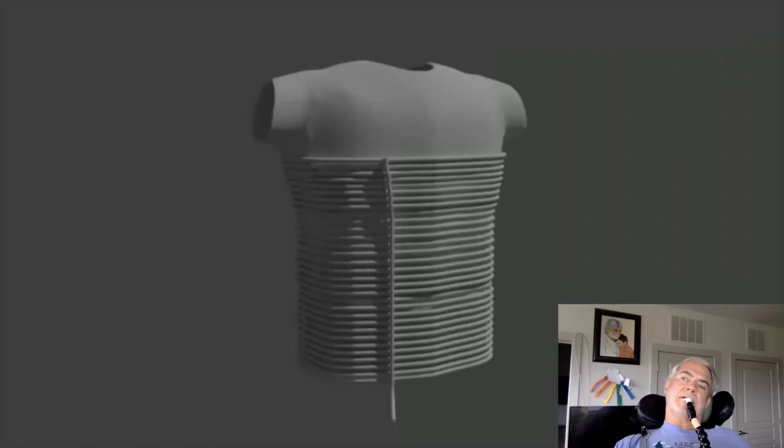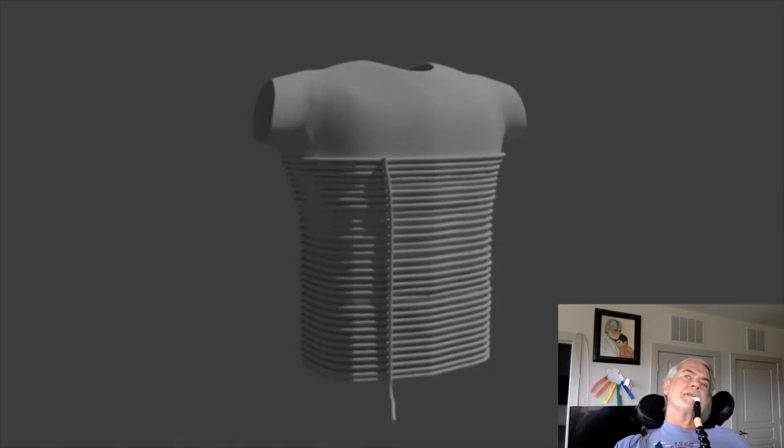One of my inventions fairly recently I call the conformal vest ventilator. It's a ventilator that, instead of having something blowing air into my lungs through either my mouth or my nose or both, my chest wall is sucked out, kind of like an iron lung, but it's wearable and conforming to the body.